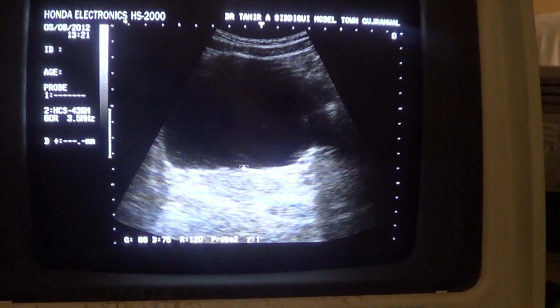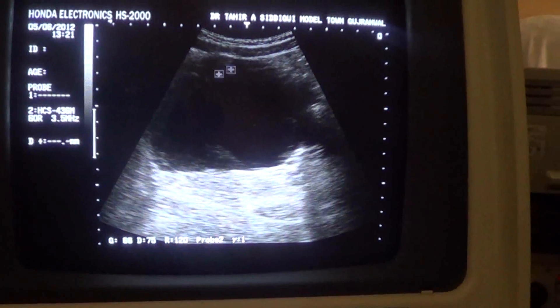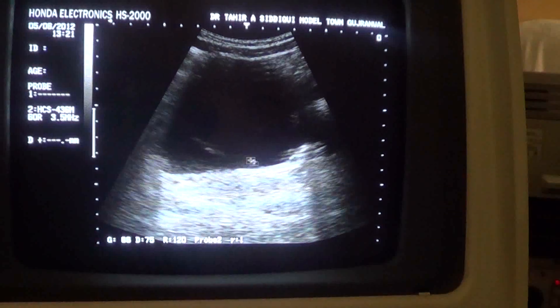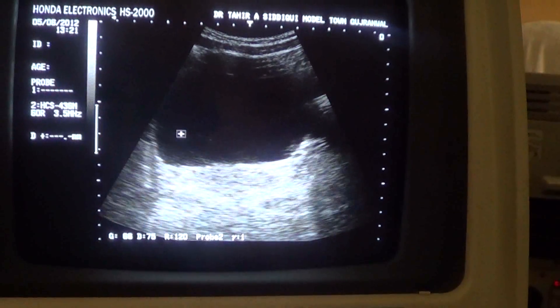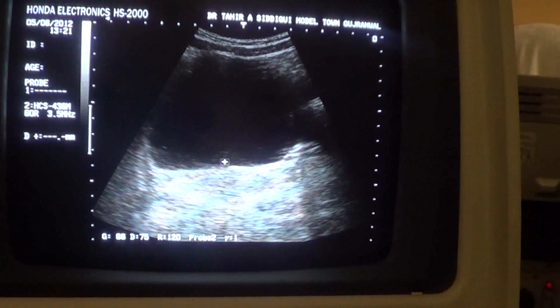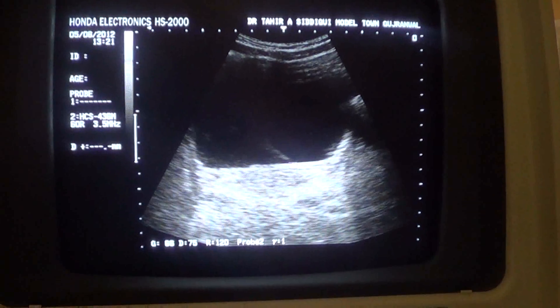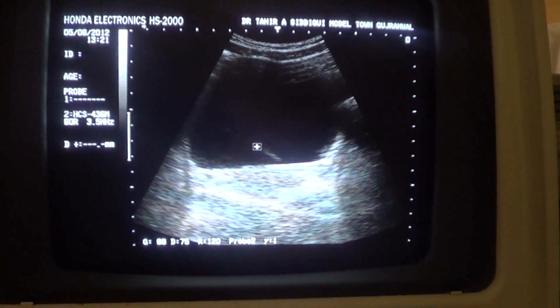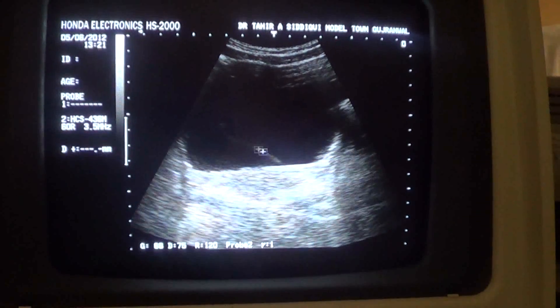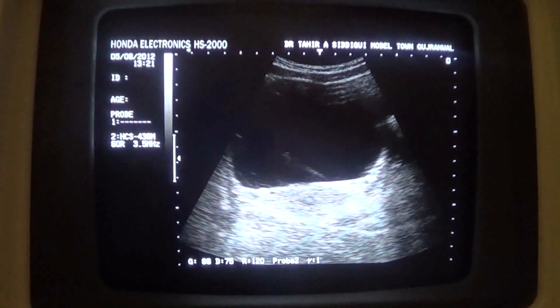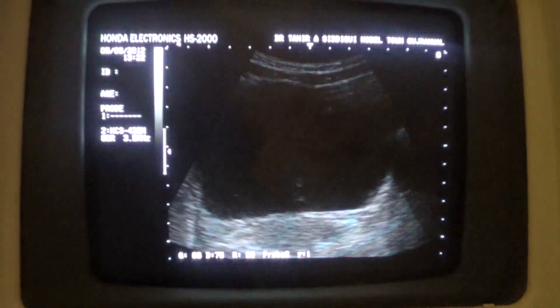This is the urinary bladder in the transverse section, and this jet of white echogenic area you are seeing is the urine entering the urinary bladder. This is the urine jet from the urinary bladder.